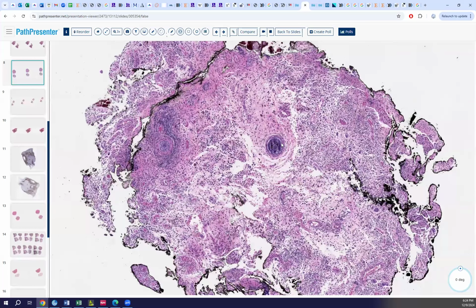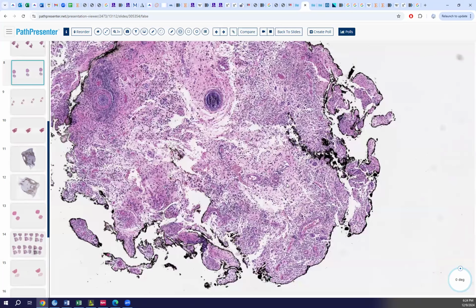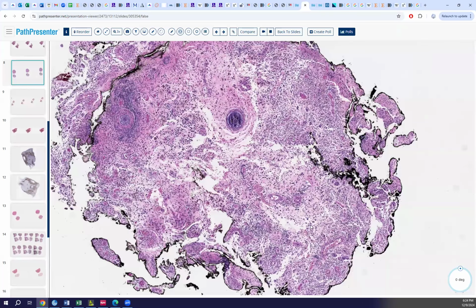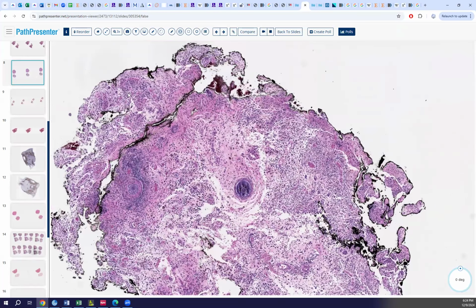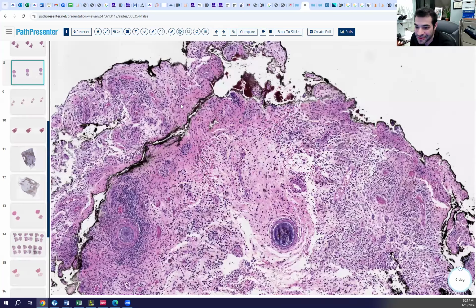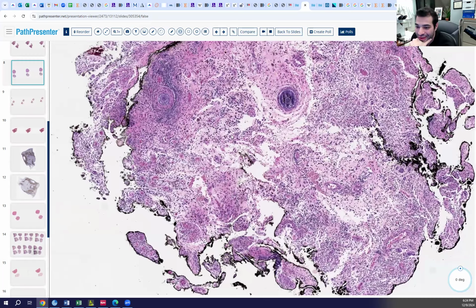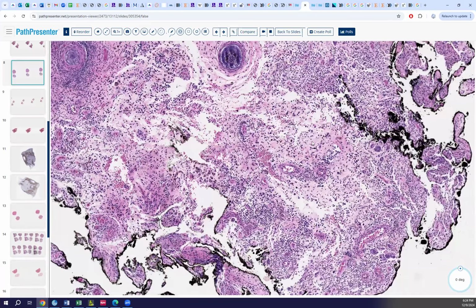Armageddon. Chaos. Like dead bodies. What kind of tissue does this look like? Does it resemble almost like a malignancy? It just looks so bad. Like after you do a procedure, a wound or something, like an ulceration or a curettage.